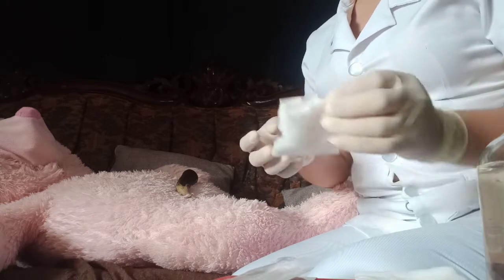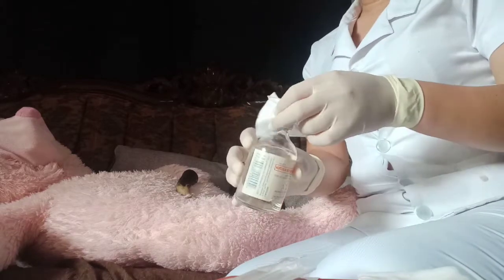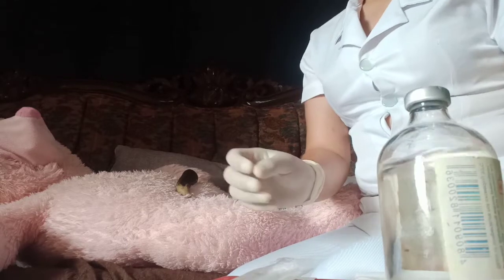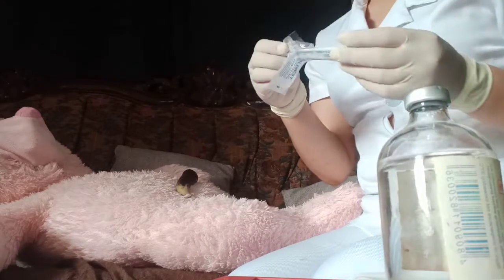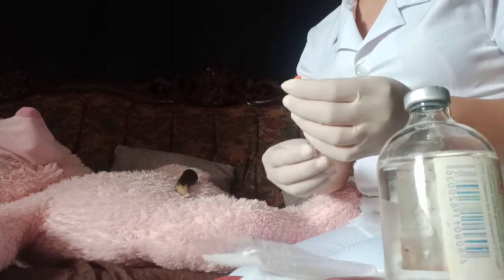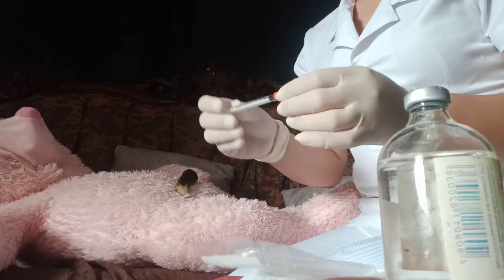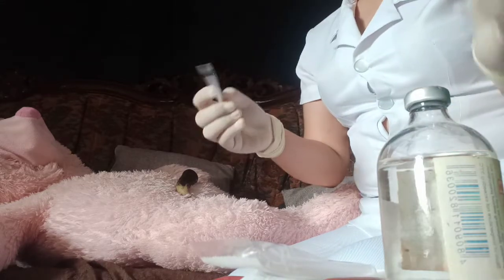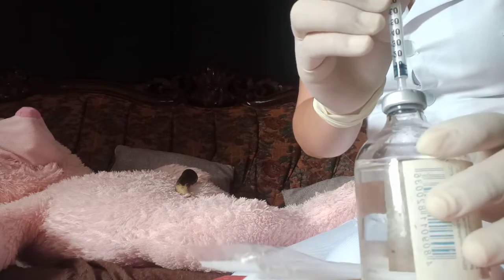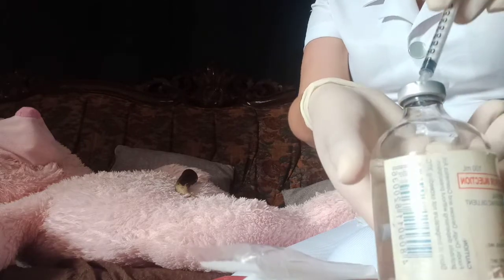Then prepare the syringe for injection. Remove the needle cap while waiting for the antiseptic to dry. Pull the cap straight off to avoid contaminating the needle with the outside edge of the cap. Then inject the medication. Grab the syringe in your dominant hand by holding it between your thumb and fingers.